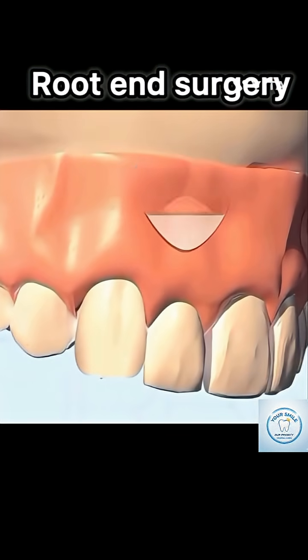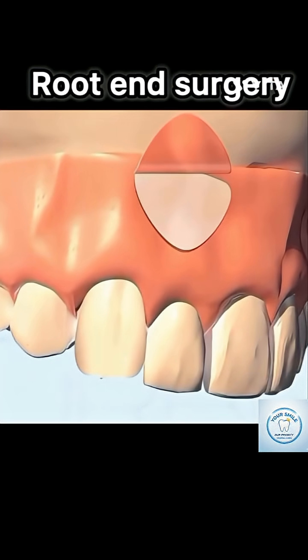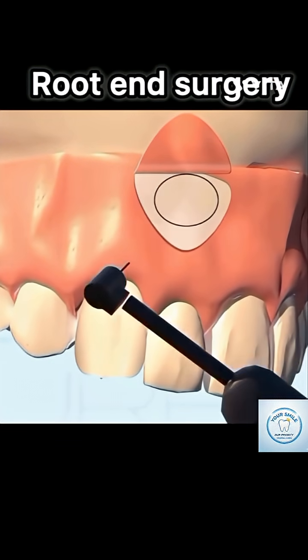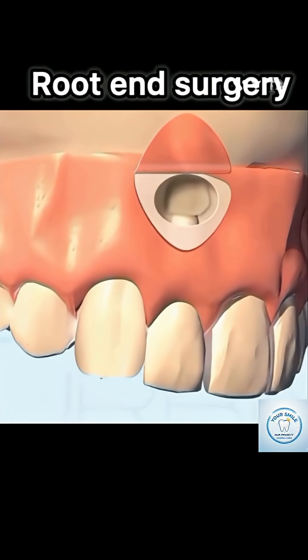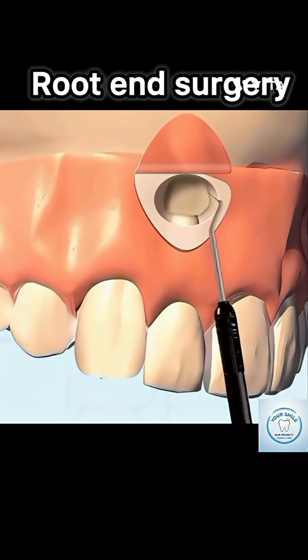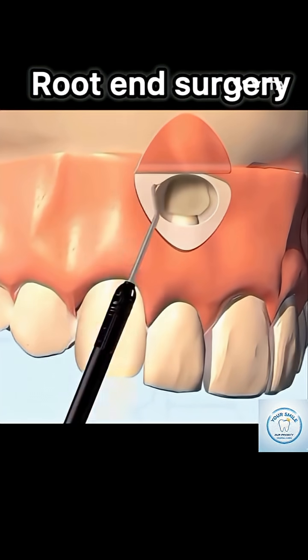First, a small surgical flap, most commonly a submarginal or sulkular design, is created in the gum tissue and gently lifted to expose the underlying bone and the infected root tip.